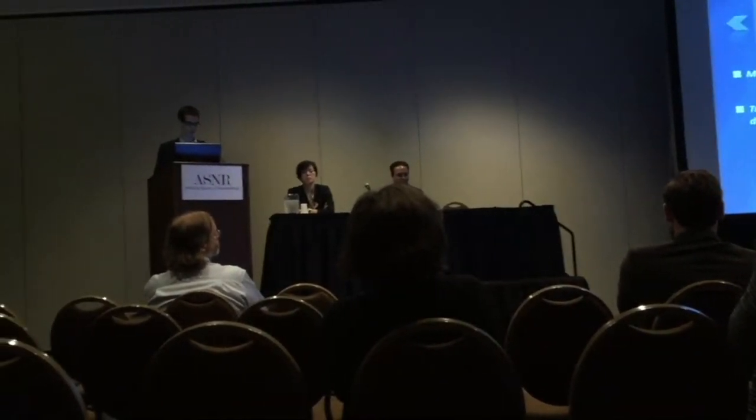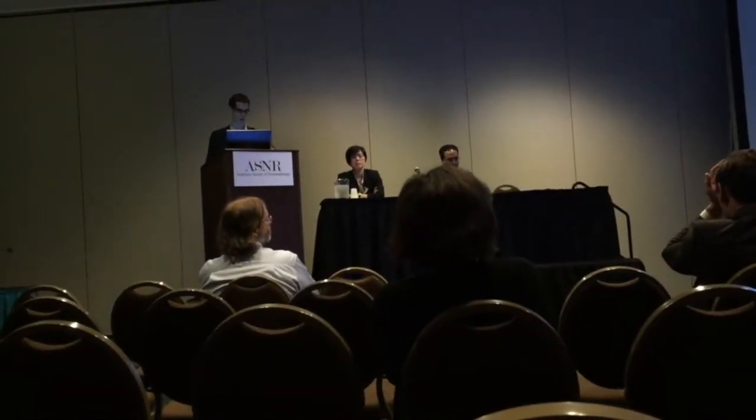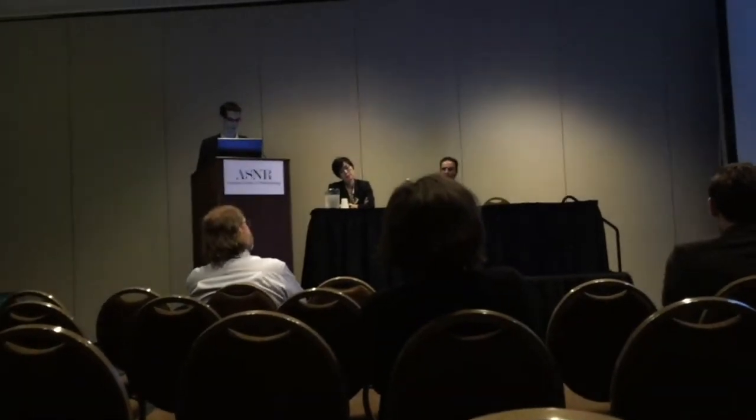Multiple sclerosis leads to millions of MRI scans around the world. Clinical modifications and treatment evaluation are the main triggering factors to control MRI of these patients, looking for dissemination in time. We use McDonald's criteria to assess dissemination in time, and especially the appearance of new FLAIR hypersignal.